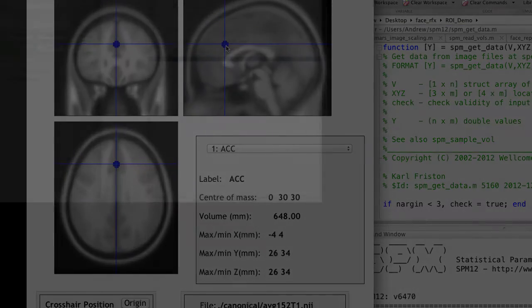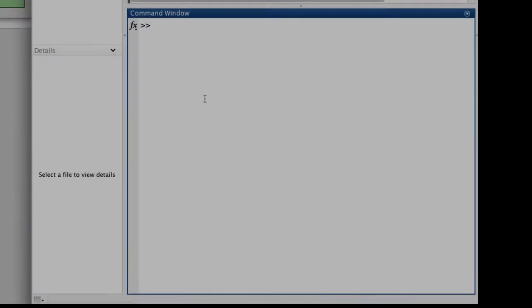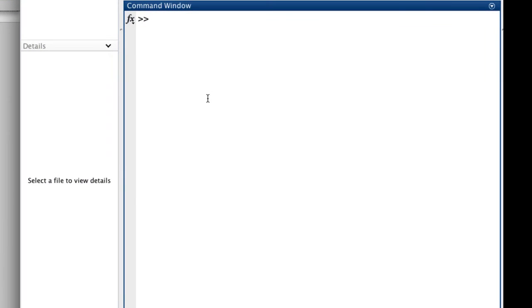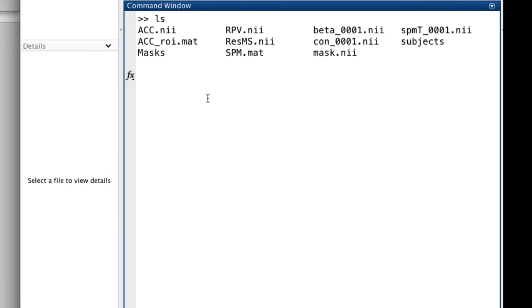Now, let's do this from the command line in SPM. In my second level directory, I have that spm.mat file I was just talking about. If you want to access the fields you need, type load SPM, all capital letters.